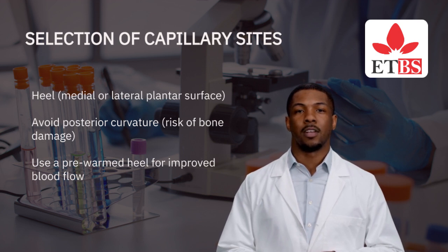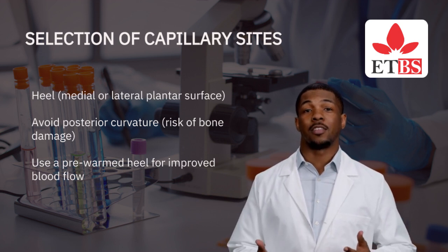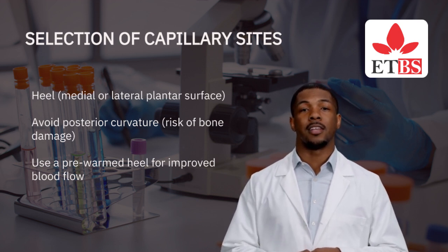Sites to avoid: swollen or cyanotic areas, previously punctured sites, infected and inflamed areas. Fingers of newborns under 6 months, risk of osteomyelitis.